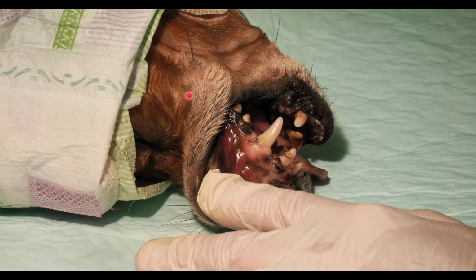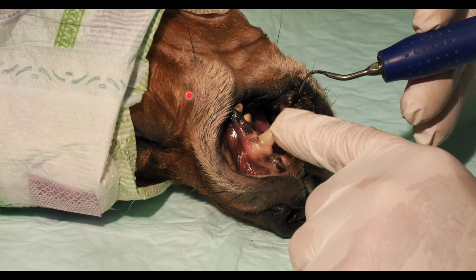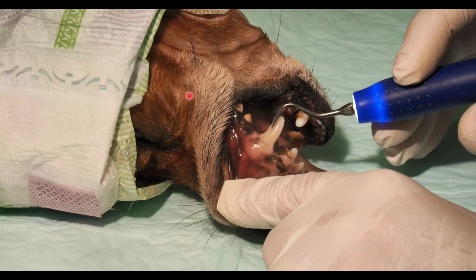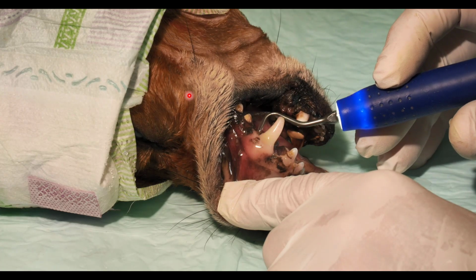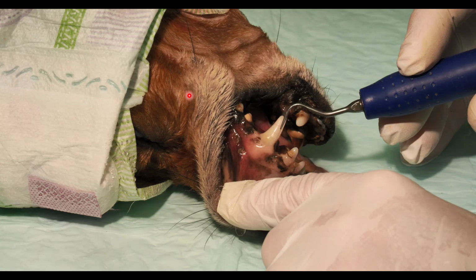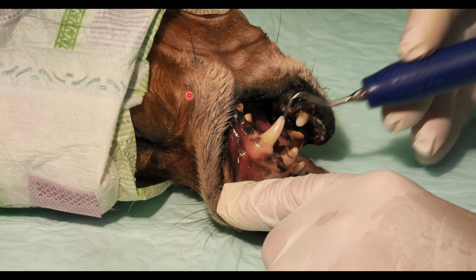And you can certainly do a lot of this with an ultrasonic scaler. But again, like we discussed in the equipment section, you've got to have a subgingival tip. If you notice, this is a finer tip than what I used for the supragingival part. So now we're going to do the same thing where we turn it on. This should be a little bit lower power. And then you're going to go underneath the gum line. And I think that your subgingival scaler does a pretty good job cleaning down to about 3 millimeters, which is normal for a dog. And now you're just going to continue that along the arcade and making sure you get everything clean. Because remember, the subgingival cleaning is the most important.